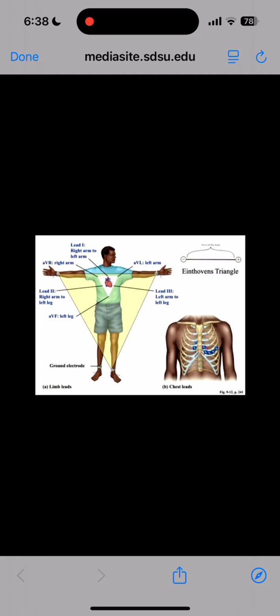Okay. So how do we measure an ECG? It turns out that historically there was a Dutch physiologist physician named Wilhelm Einthoven. And he was interested in not only the heart and the body, but how we can actually measure electrical events outside of the body. And before, I should have asked you guys, have you all heard about triangulation? Some of you maybe?